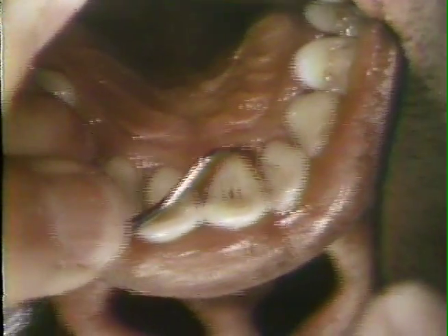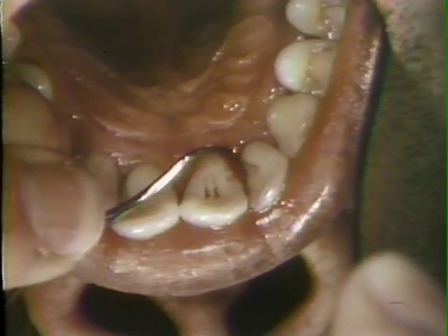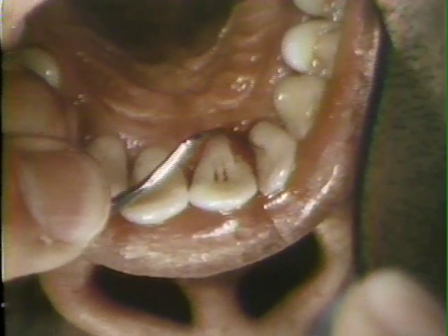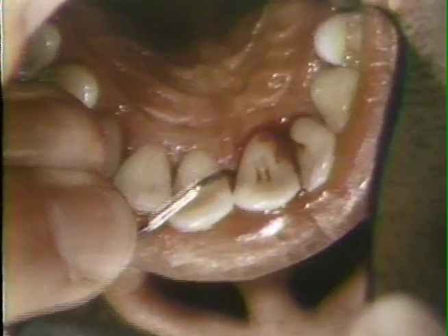On the palatal side, either a jaquette type of sickle scaler or a small curette may be used. Special attention must be paid to the cemento-enamel junction and the interproximal surfaces from the palatal aspect.